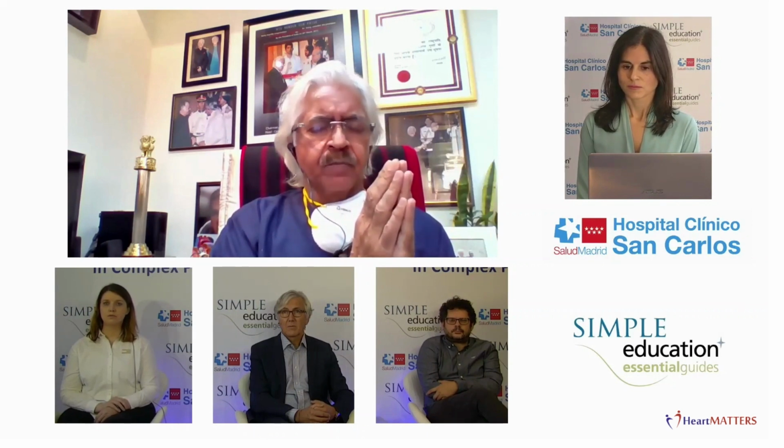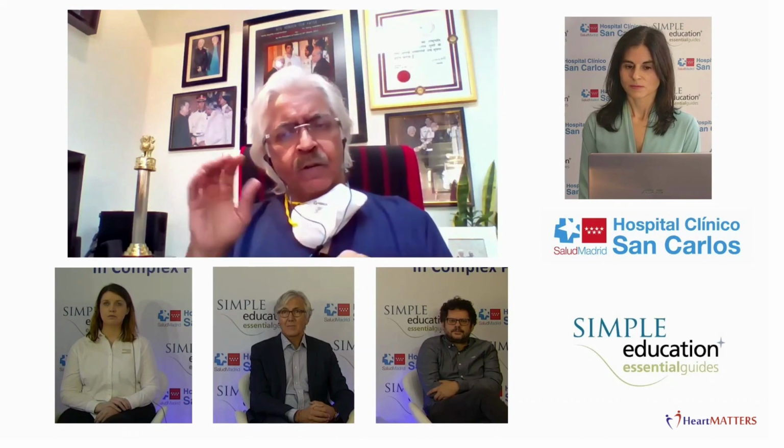Therefore, for the new entrants into this whole interventional cardiology field, the only way they can actually optimize... we know that in most instances, our eyes can optimize results because we go for larger lumens, we always go for post-dilatations and so on. And so we are less surprised at the imaging findings and physiological findings, but it's so important to be able to correlate the final angiographic result, which is usually, when assessed by imaging, very poor.